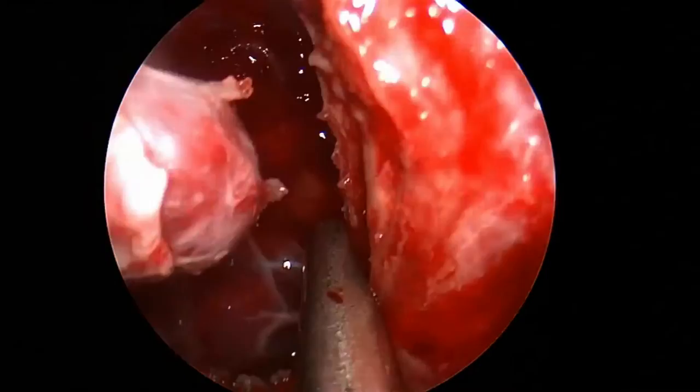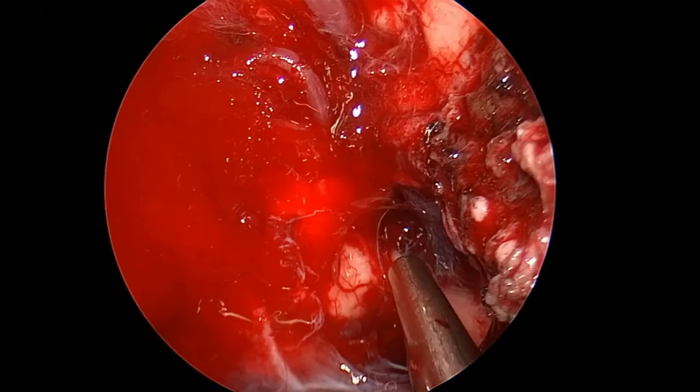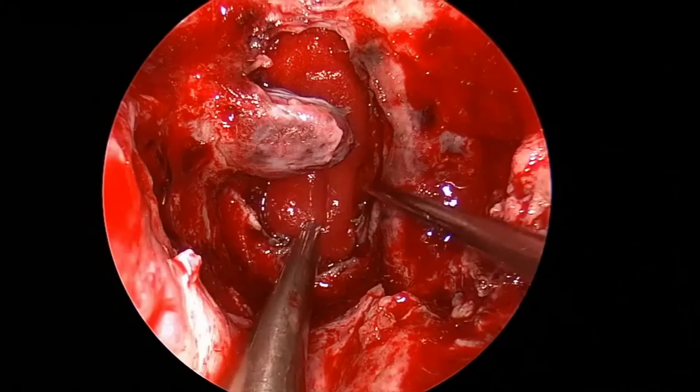And this is after complete resection of the tumor. We see the sixth nerve on the bottom, SCA and PCA superiorly. That's the fourth nerve up there. And now the trigeminal nerve. And the oculomotor nerve on the top.